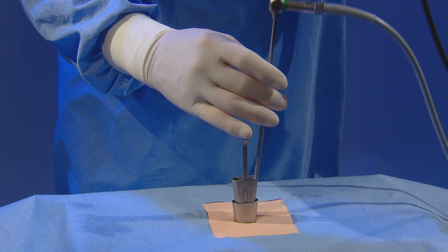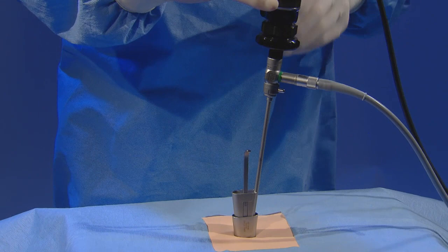The endoscope and camera are in position. The suction cannula is in its channel and the instruments are inserted into the widest channel.